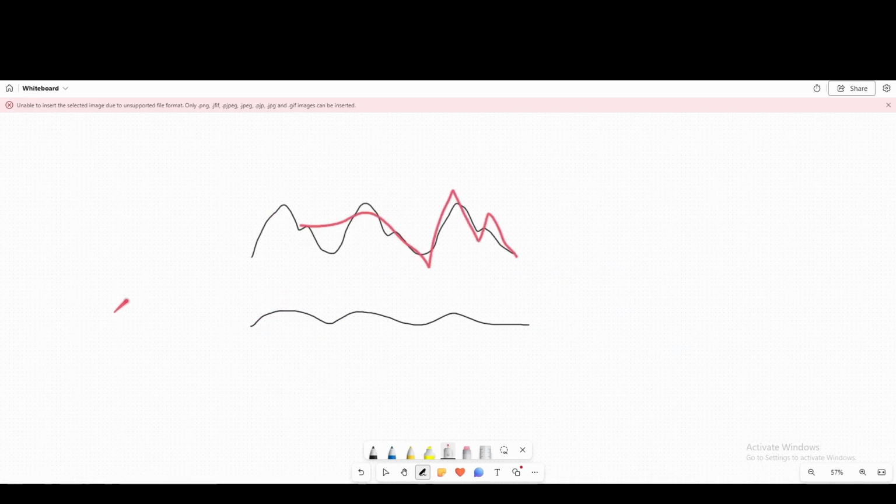Before we move on to why any of this is actually important, we're going to be talking about Pleth waveforms, right? So this is what you get from your pulse oximeter. Again, it's just what it's actually reading, charted over time, right? You got time down here. So this is your healthy waveform, right? In terms of anatomy of this, you've got your anacrotic limb. That's the part where it shoots straight up, followed by your dicrotic notch, right? This signifies the aortic valve closing, also the start of diastole, right? And then it drops all the way down into this diastolic trough.